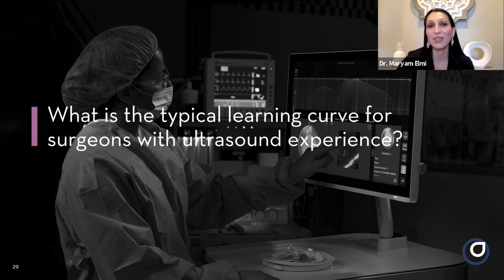Okay, I'll go ahead and answer that. I think the learning curve is actually quite fair. So I did all my training in Canada, now I work in the US. I didn't have very much ultrasound experience. I had some, and then the training for the perimeter OCT imaging device was a weekend course where it was really 2 half days, Saturday and Sunday.